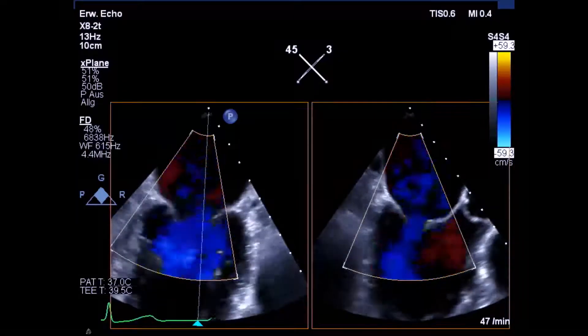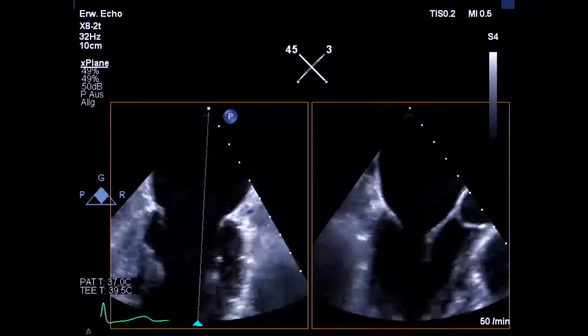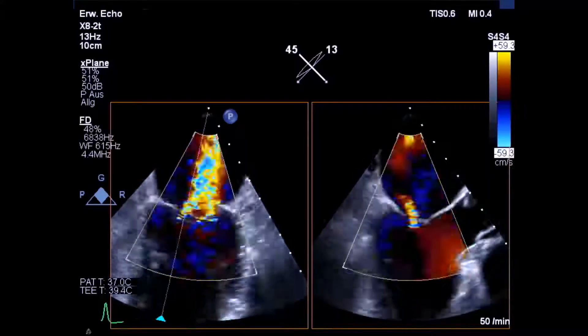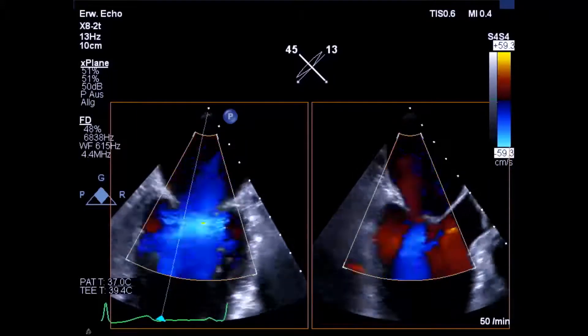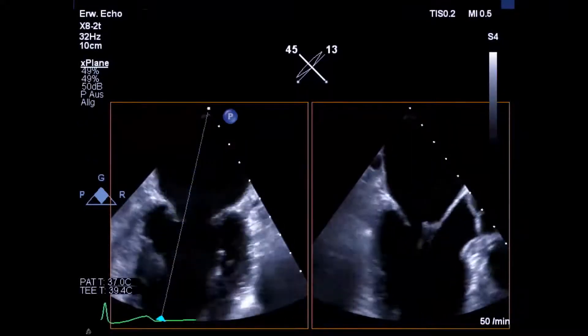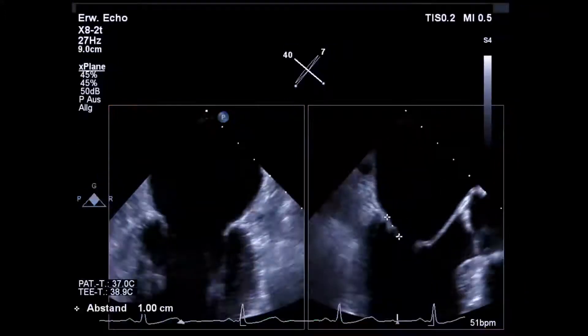Find the best intercommissorial view at 50 to 70 degrees. Take a perpendicular view in the three segments with and without color Doppler, and measure the length of the posterior mitral leaflet.